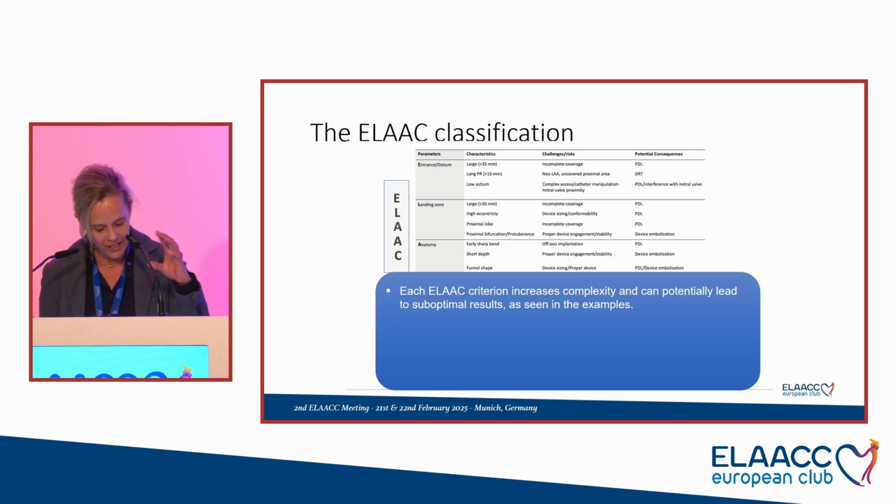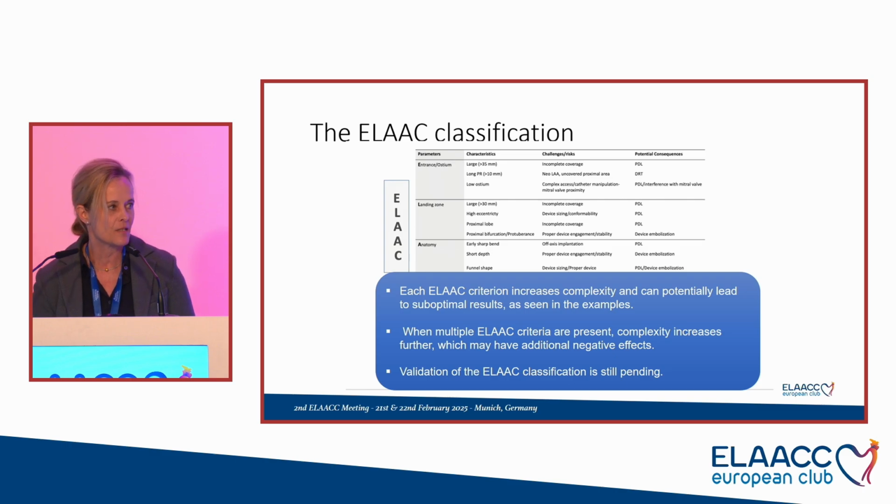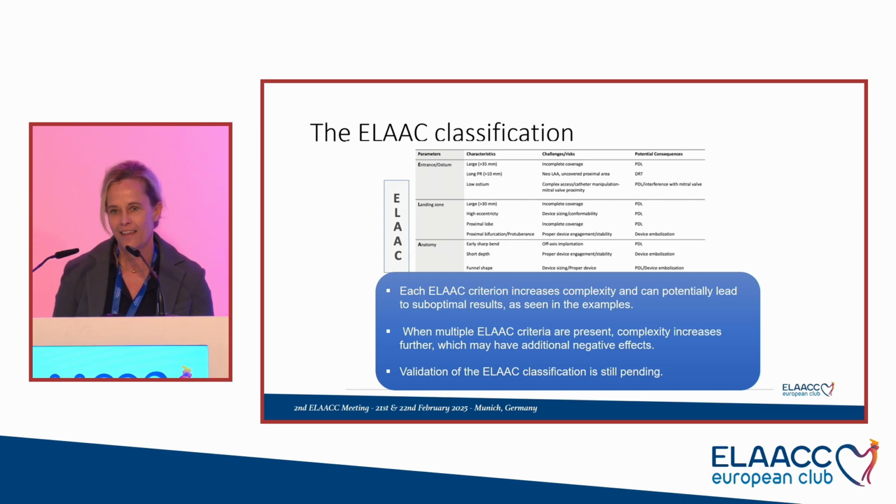And each of these ELAAC criteria increases the complexity and can potentially lead to suboptimal results, as we've seen. And when multiple ELAAC criteria are present, we could assume that the complexity increases further, which may have additionally negative effects on the outcome of the patient. But this needs validation, as we already discussed. Thank you for your attention.